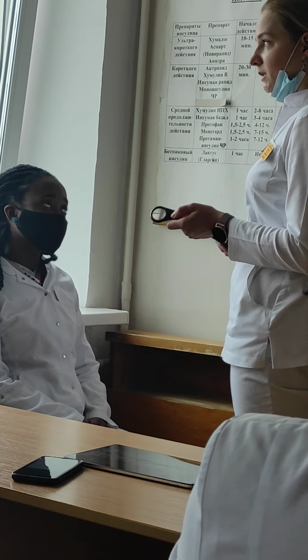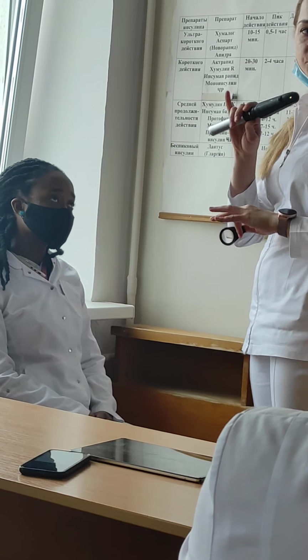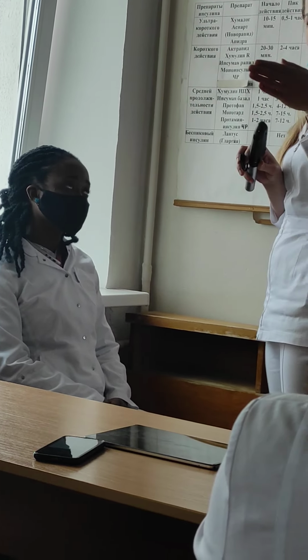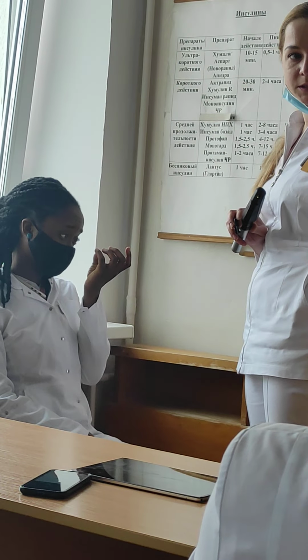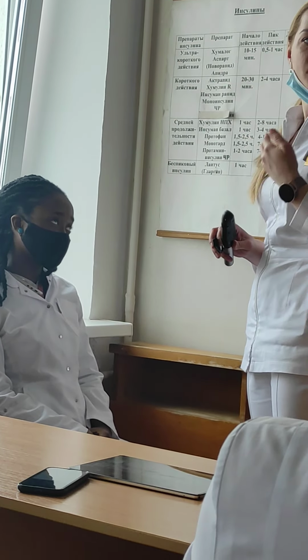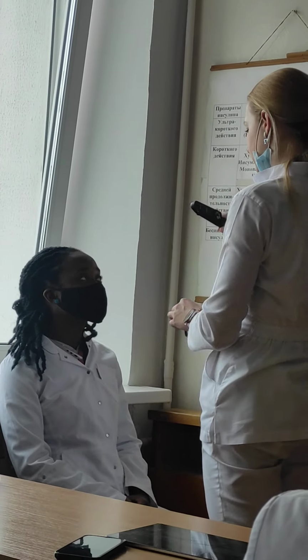To see the optic nerve disc head in the right eye, we need to ask the patient to look at the small finger of our right hand. In this position, the eye is turned a little bit, and the optic nerve is not placed centrally. It's placed a little bit to the temporal position. So in this position of the eye, we can actually see the optic nerve disc head, asking the patient to look at the small finger.